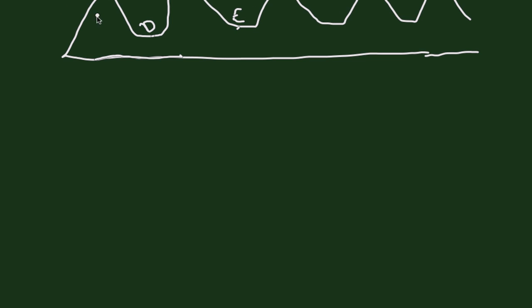We know that the flow of blood through the placenta increases or becomes less resistant as pregnancy progresses under normal circumstances. So earlier in pregnancy, less diastolic flow is not necessarily abnormal. There are nomograms for what is considered to be normal throughout gestational age. This is a demonstration of a normal umbilical artery waveform.